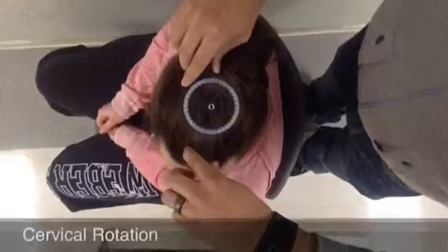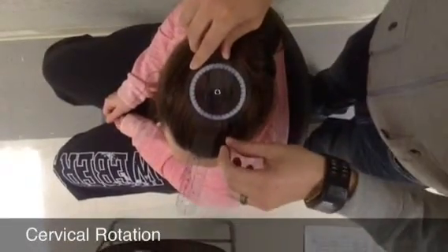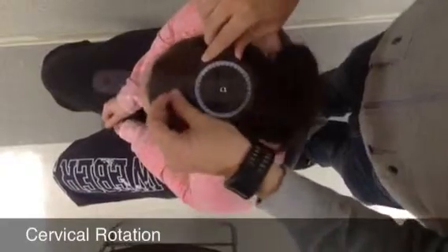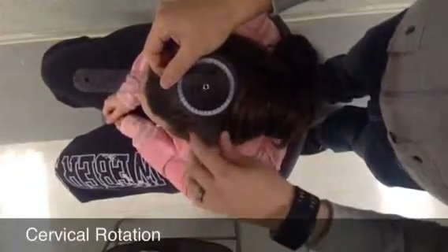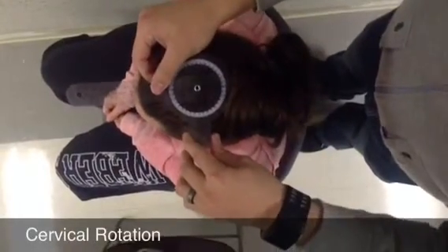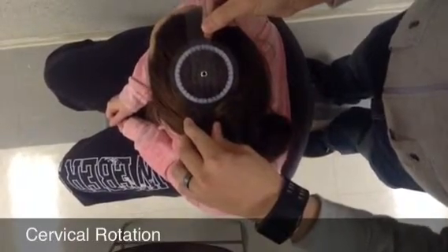With cervical rotation, the axis is placed over the midpoint on the top of the head. The stationary arm is parallel to a line joining the two acromion processes. The movable arm is aligned with the nose. In the start position, it will indicate 90 degrees. This is recorded as 0. The average range of motion for cervical rotation is 45 degrees.